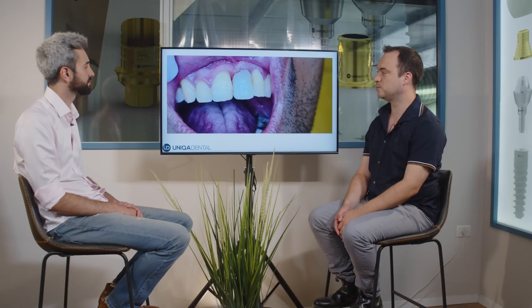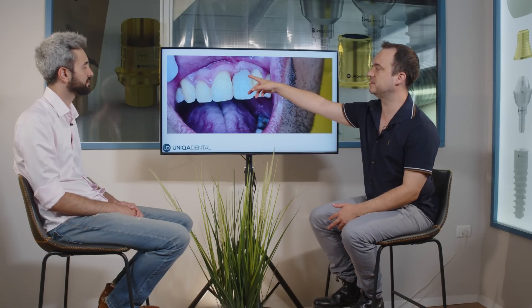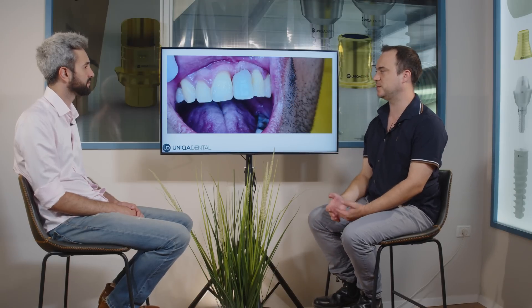Here you can see the morphology of the crown. This will be the final morphology. Right now it's a temporary restoration, but this will be the morphology because you need to have space in this area for the T-base.